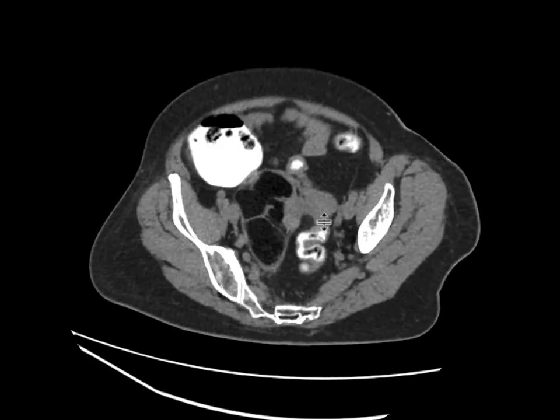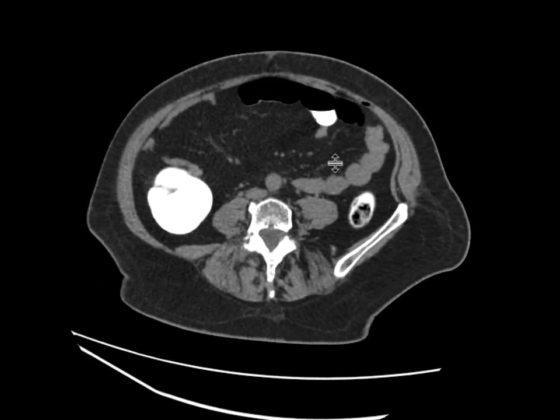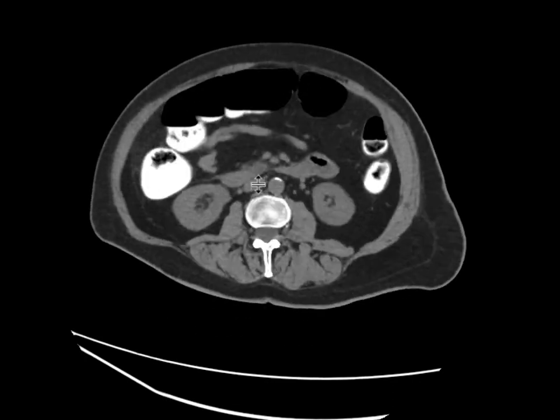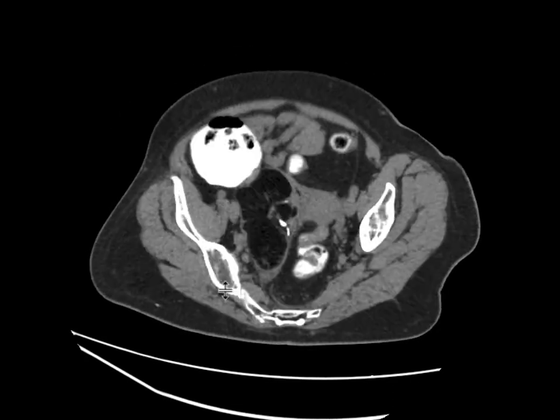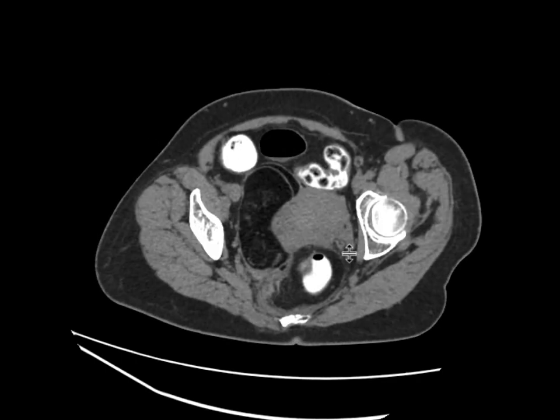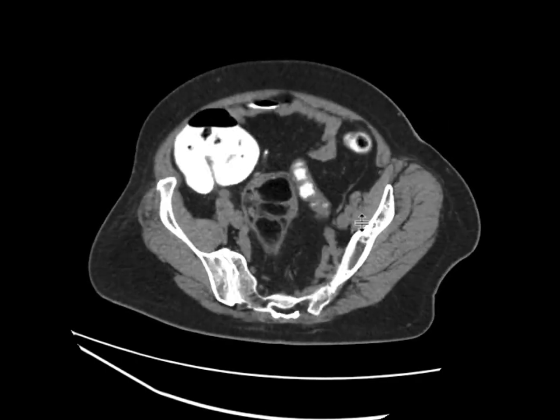This is the uterus over here, and if we follow the gonadal vessels on the right side — here it is — draining into the IVC, and following it downwards, it goes right into this mass. And so this is a large right ovarian dermoid.